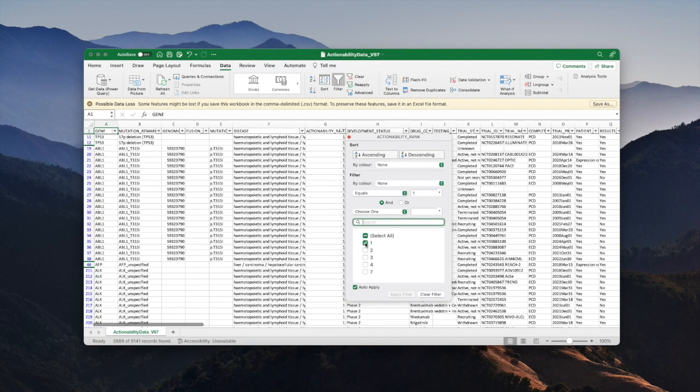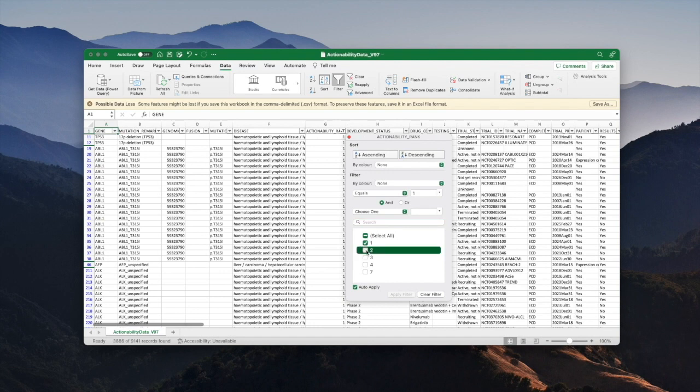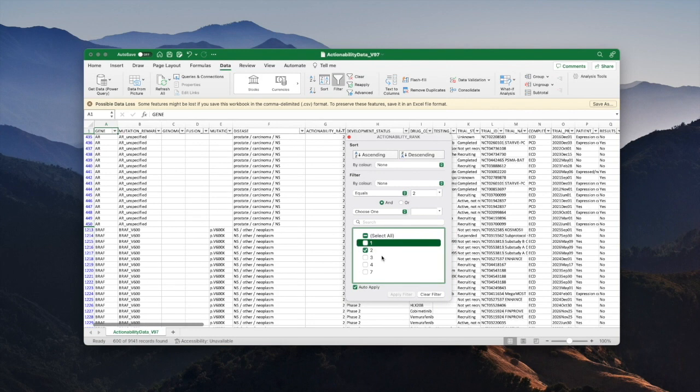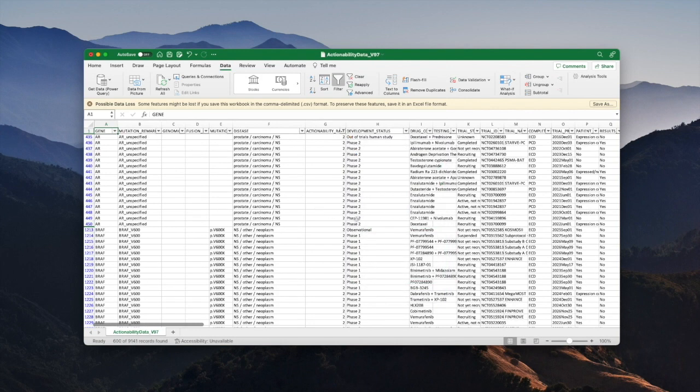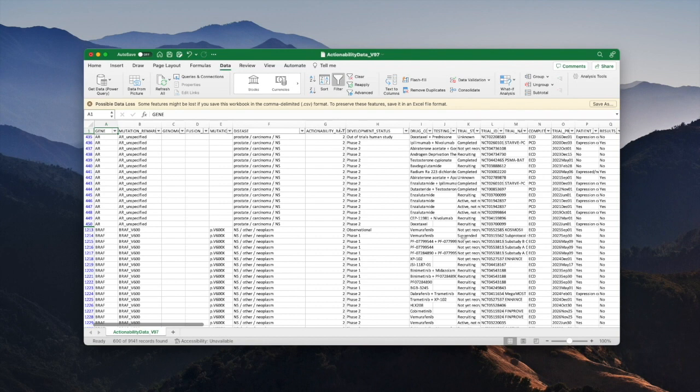When that's the case that would trigger actionability ranking of two. So I'm going to apply the check mark for two, switch off the check mark for one, and now what we're looking at is a list of the combination of a mutation and a disease where at least one of the trials had a promising, encouraging result.